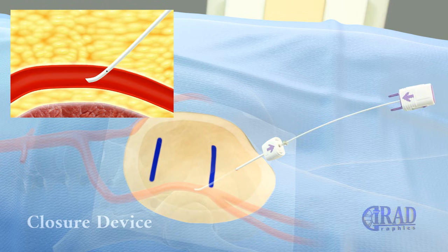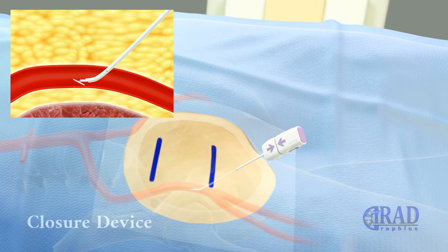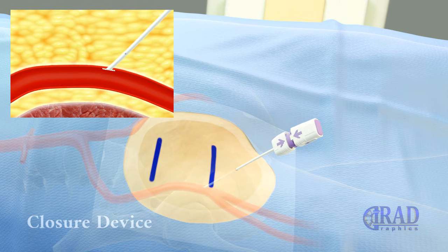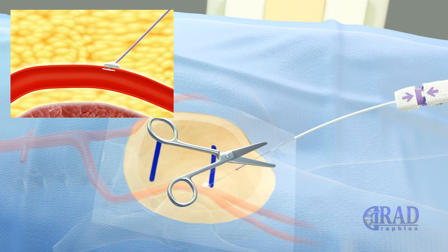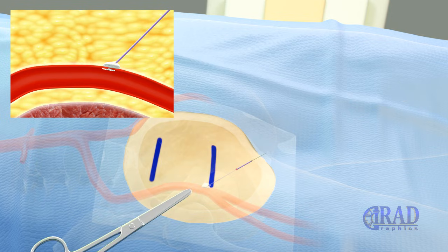The collagen plug carrying component is assembled and advanced into the sheath. After attaching and clicking the last part, the whole sheath is pulled out until resistance is felt. After feeling resistance, the middle plastic piece is pushed back over the string into the tract until the collagen is packed on the outside of the common femoral artery. The string is then cut by scissors in the middle part, and after removing the middle plastic piece, the rest of the string is trimmed at the level of the skin.